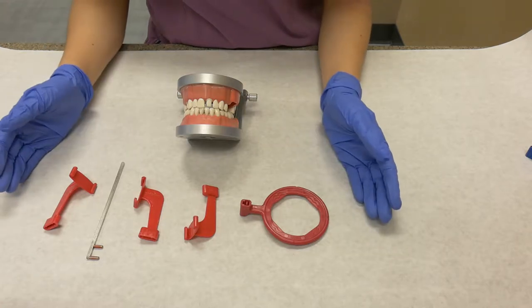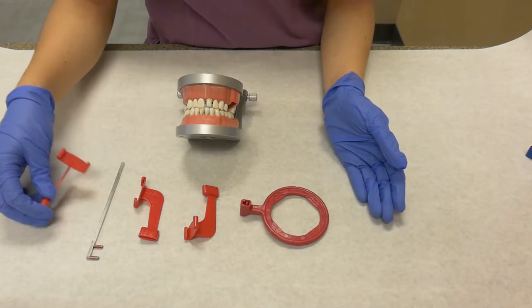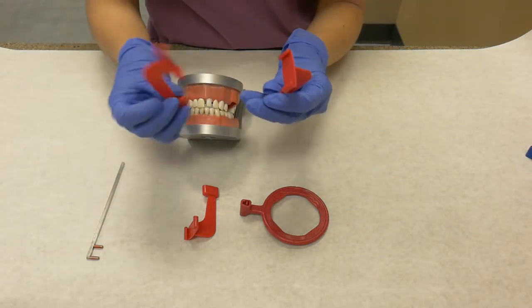The red XCP is used for bite wings, and this setup has three different bite plates.